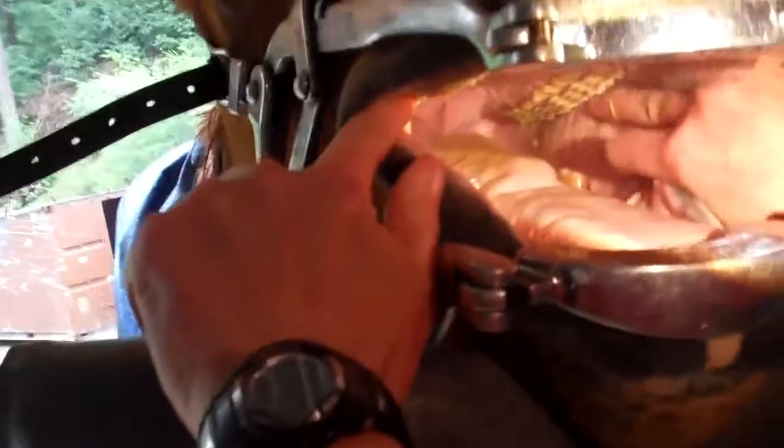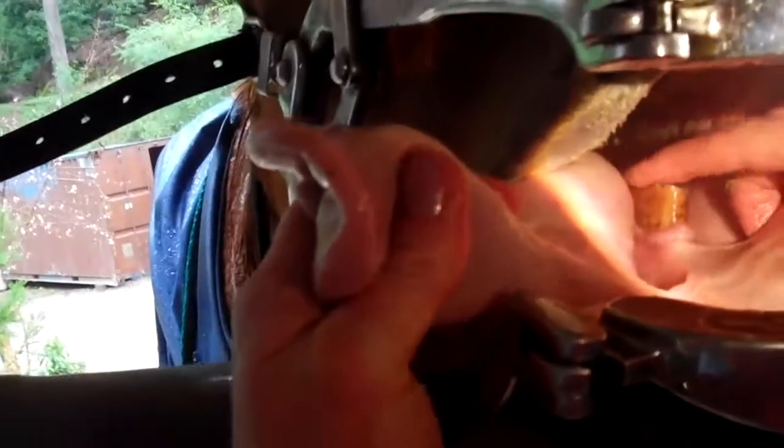You want to look in? That's what it looks like before float. See the sharp outside edge of the upper teeth? And the sharp inside edge of the lower teeth? And ulcer — see? And cheek, where that point's been poking her. That's the reason for the tooth float.